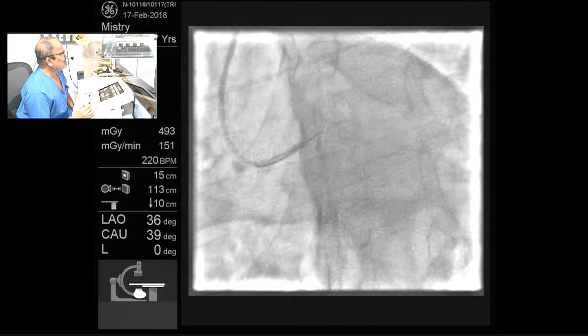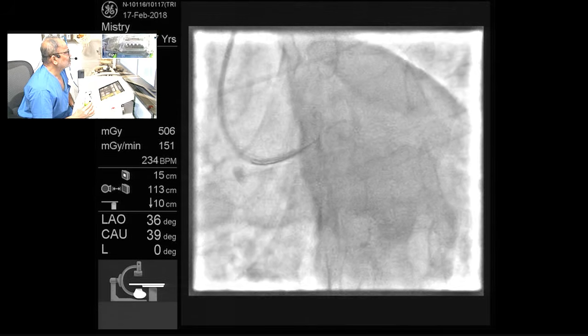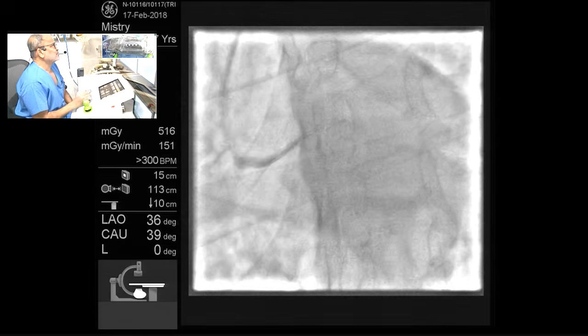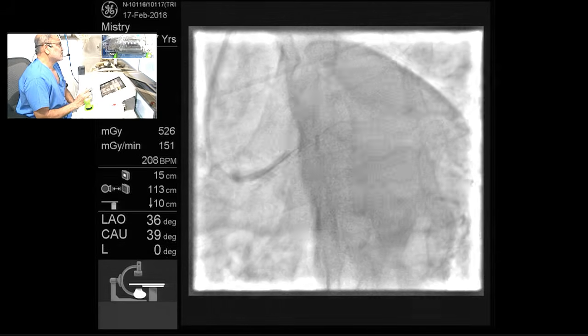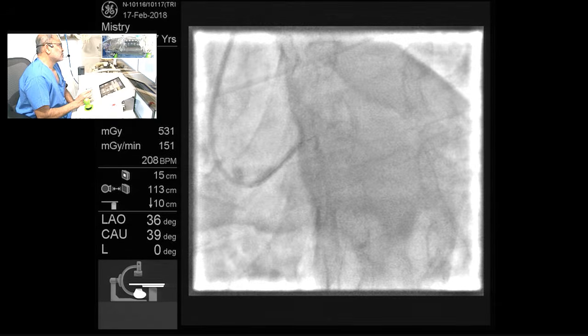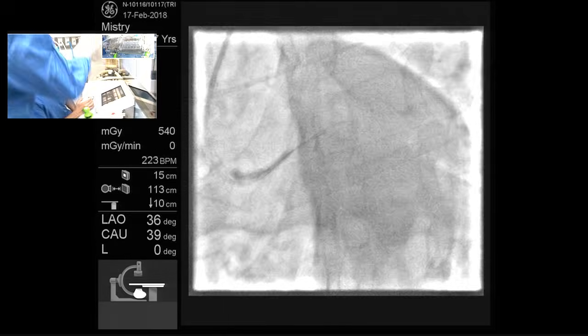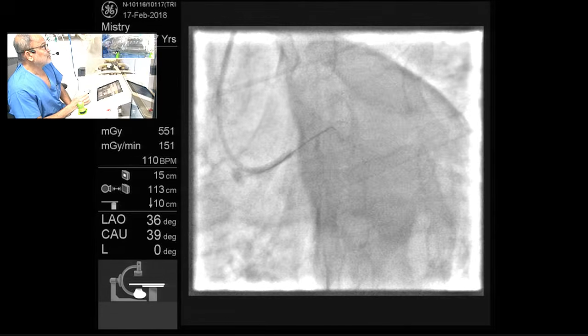Can push a little bit, slowly. Or we can make it loop by sending it in the circumflex, so the second curve will automatically come.